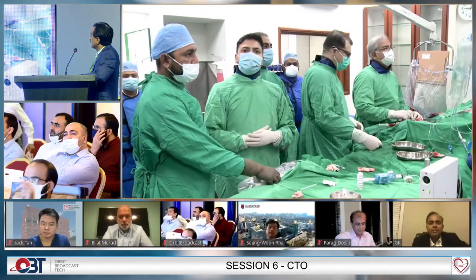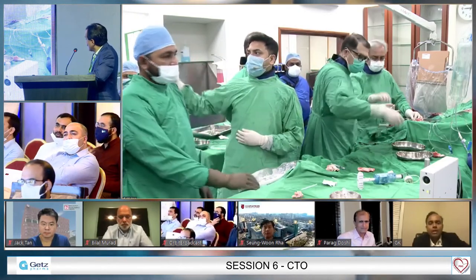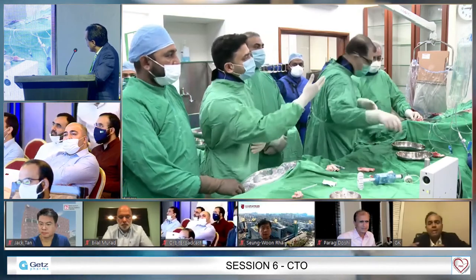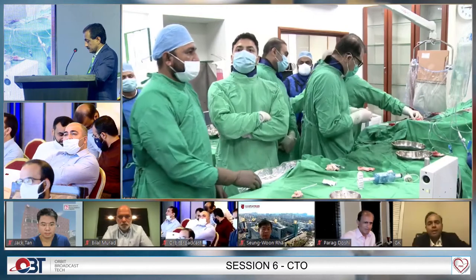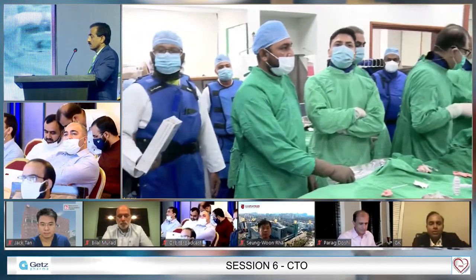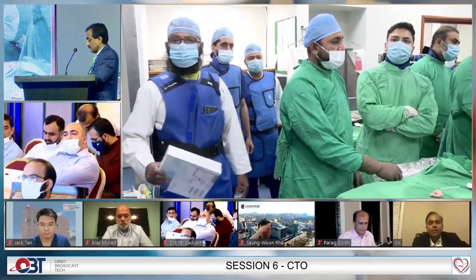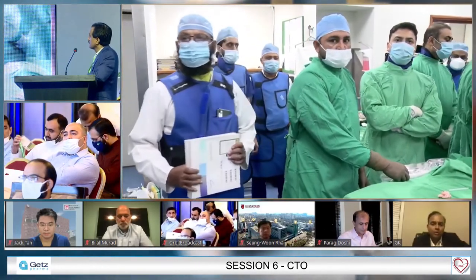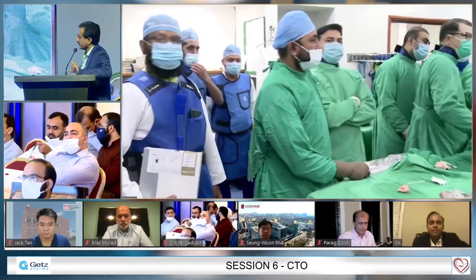Really come up with a second system that can be used to advance your covered stents or coils. And it's also important to remember the size that your covered stent is going to go through. It's going to be hard to get old generation Graftmaster without a 7 French. But on the other hand, the newer papyrus stents can probably go through 6 French. So those are important things to remember based on what you actually have in terms of covered stents.